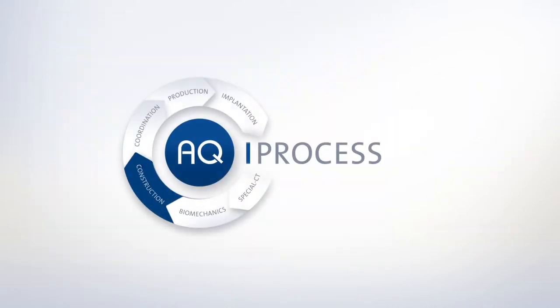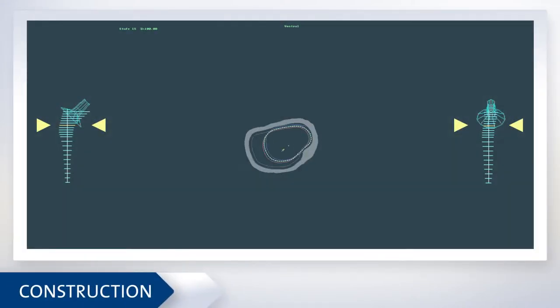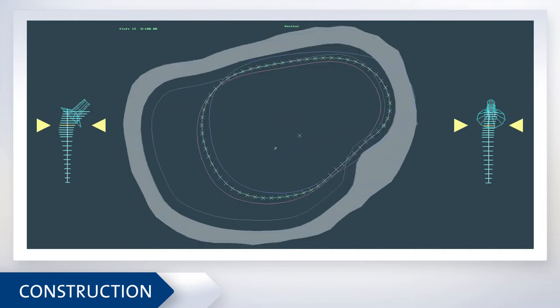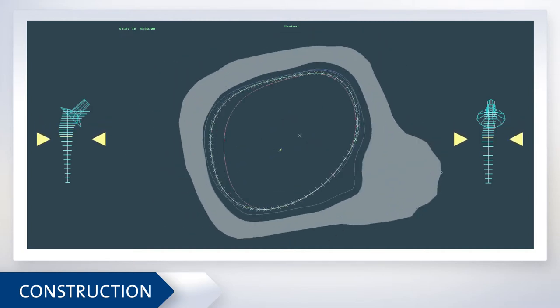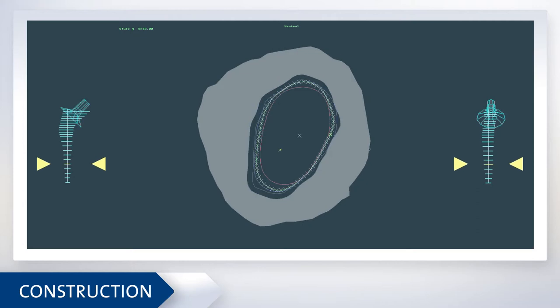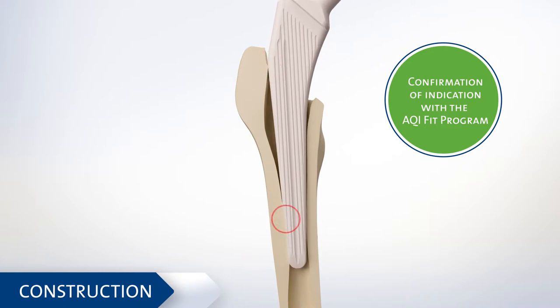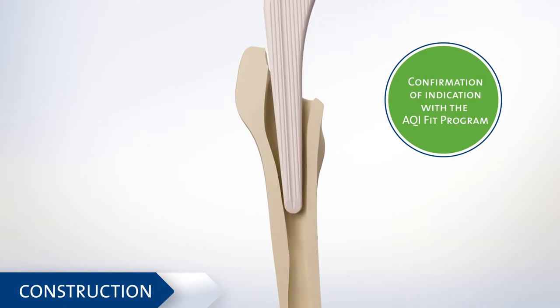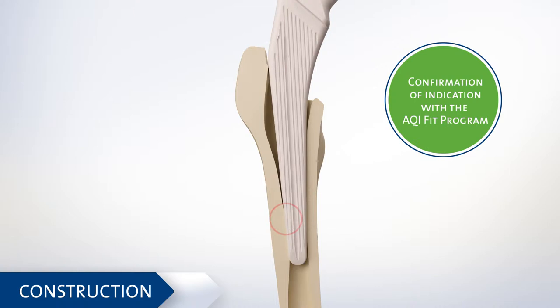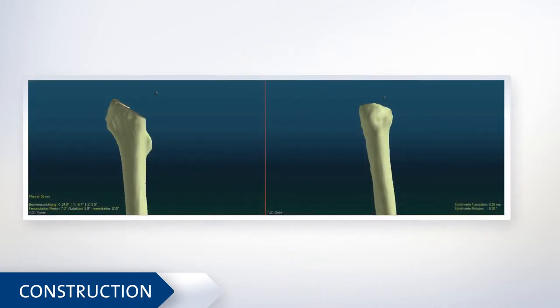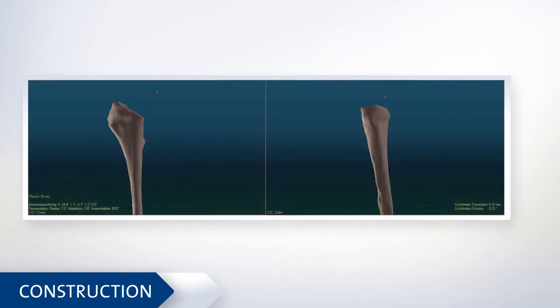Hip stem and hemipelvic prostheses are now designed. Initially, the femoral cavity is reconstructed on the basis of the CT data. With the AQI Fit Program, the defect situation is evaluated and a decision taken whether this patient can be treated with a standard prosthesis. If a custom-made prosthesis is indicated, the suitable implant design is derived from the reconstructed femoral cavity.